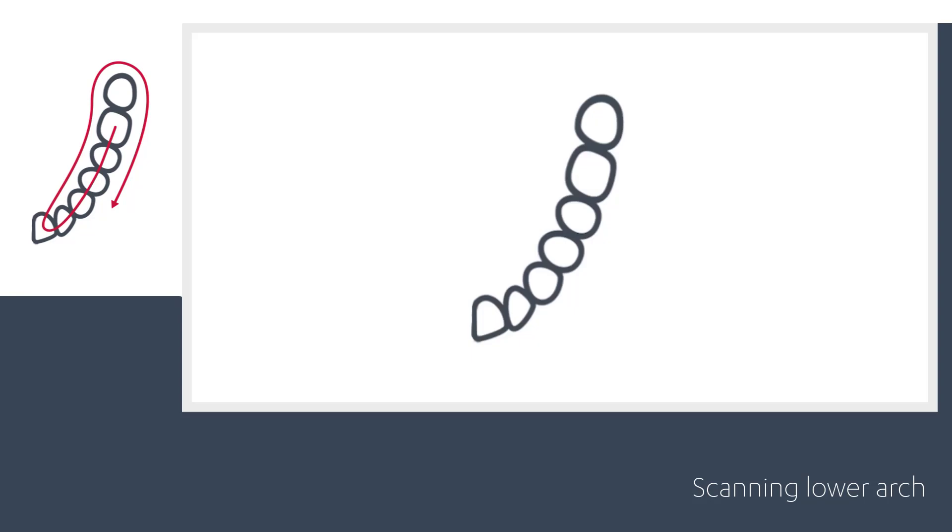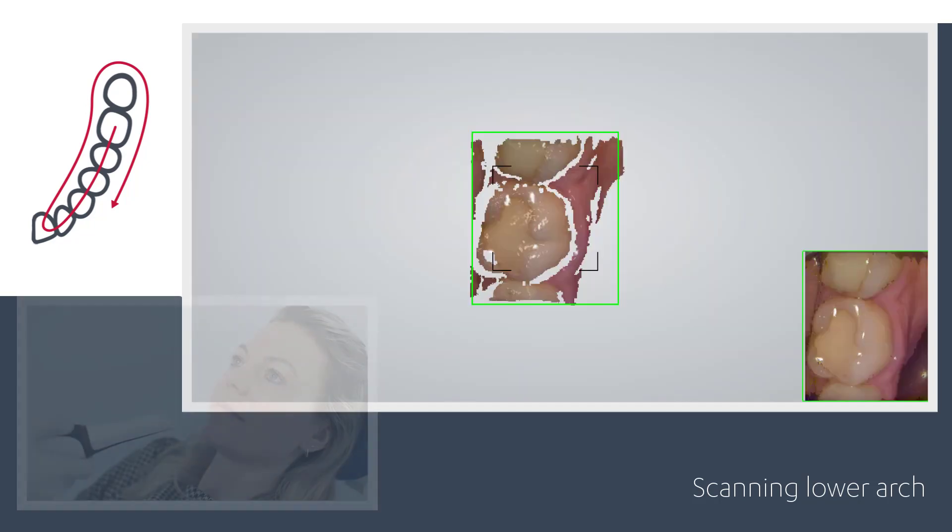The official scanning strategy consists of three swipes — occlusal, lingual, and buccal — to ensure good data coverage of all surfaces.